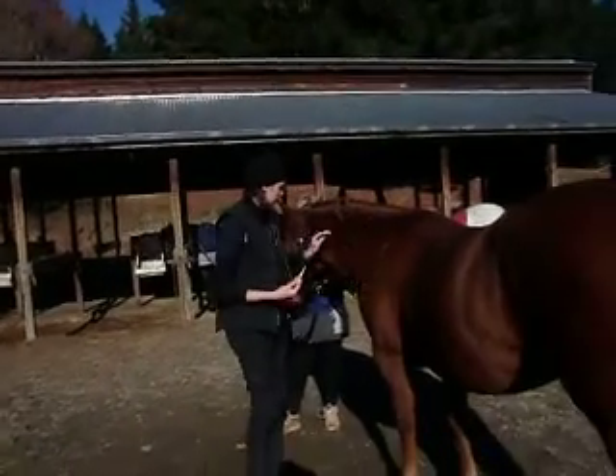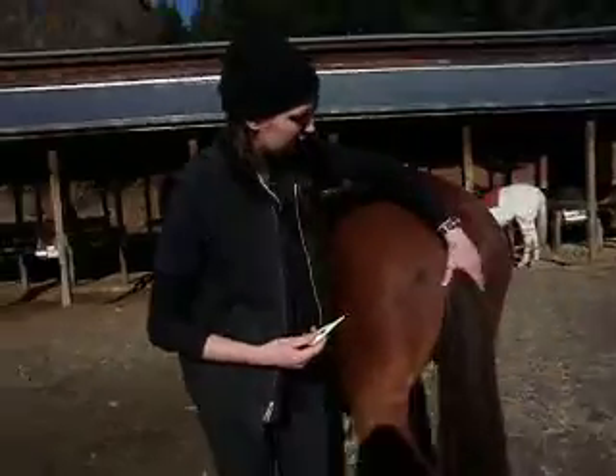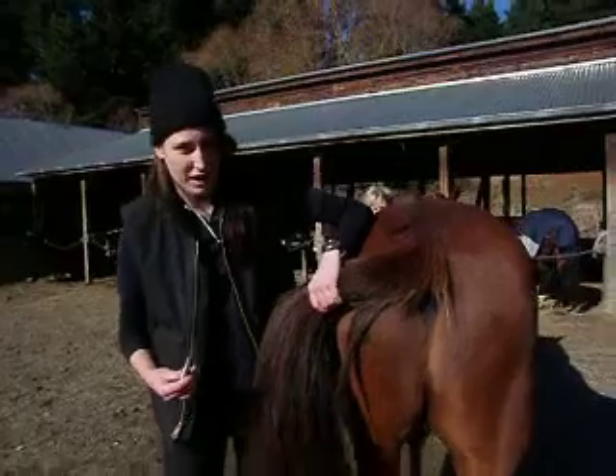I'll approach his shoulder first and work my way down to the back of the horse. Then take his tail and shift it to the side.